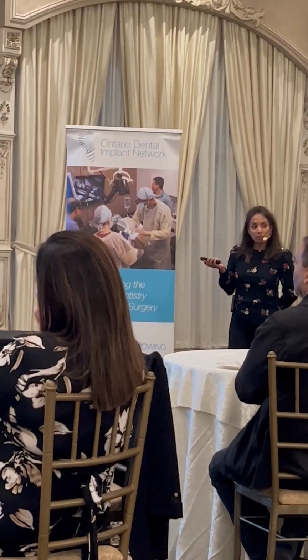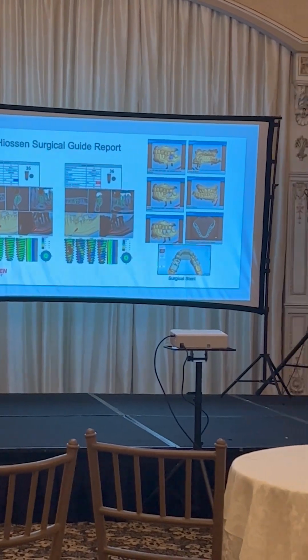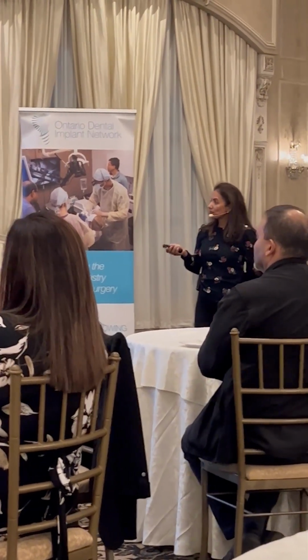This is the guided report because I do a lot of guided surgery, just like Reena. And these are the impressions, the CBCT files are uploaded, and this is the surgical stent. This is the day of surgery.